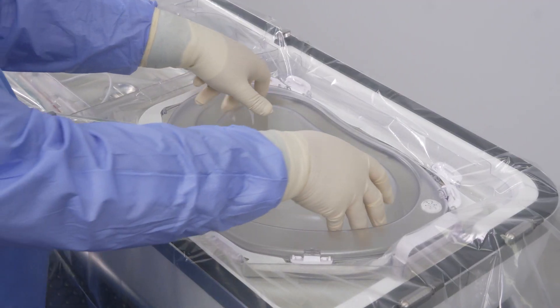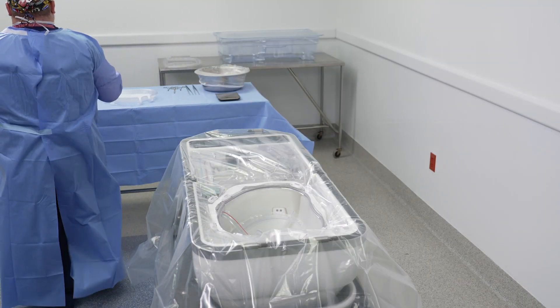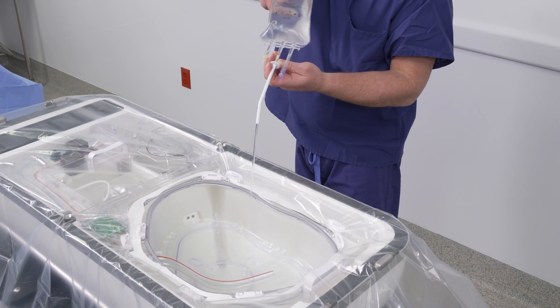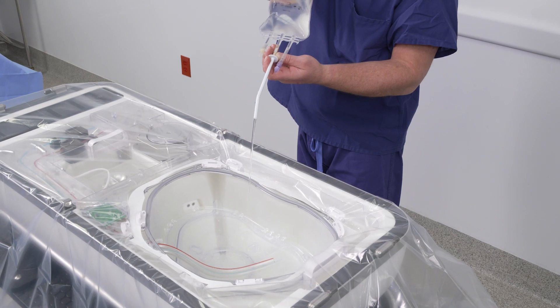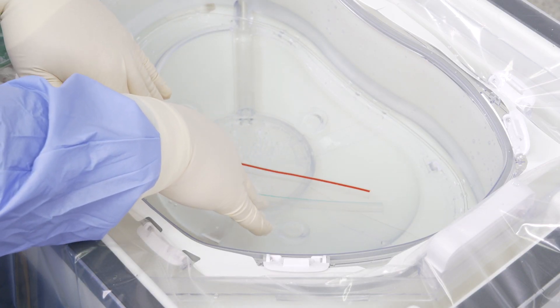Using standard aseptic technique, remove the inner lid and place onto the sterile field. Decant three liters of chilled vasosol into the organ chamber. The vasosol should be between 2 and 8 degrees Celsius. Ensure that the ends of the infused lines are submerged.